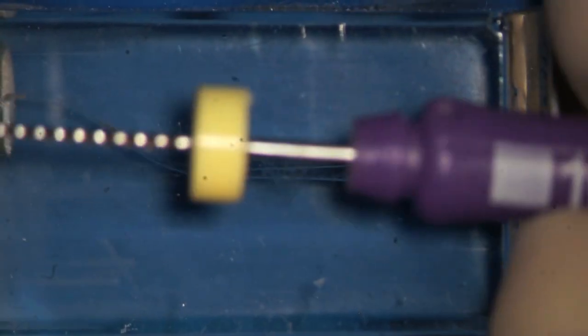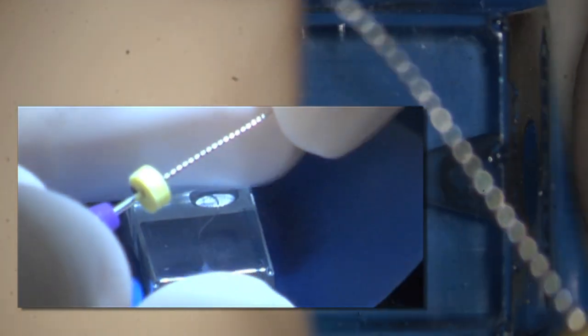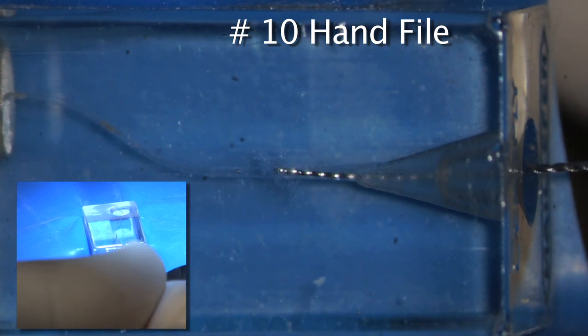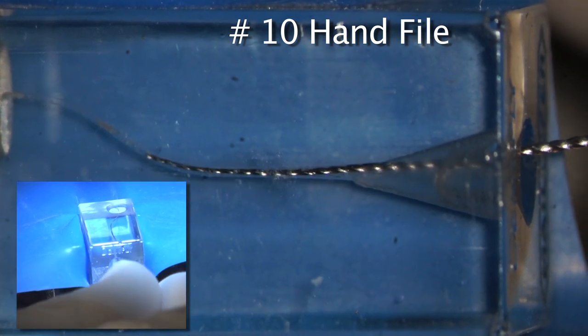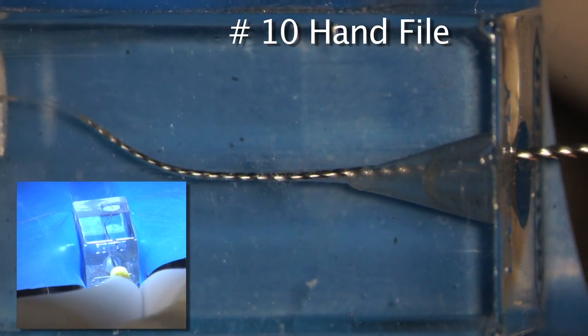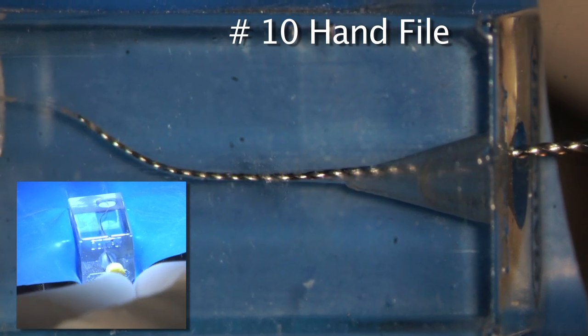So we have a ten file at the diagnostic length, and what I'm going to do is you can use a variety of different ways to pre-curve your instruments, but I'm going to put a little curve on the file. I'm going to exaggerate the curve, I don't know exactly what the curve is, because clinically you wouldn't be able to see. So we'll just put a little curve on the file, and we'll be using a little watch-winding motion to thread the pre-curved file down through the body of the canal. If the file at any time meets resistance, pull. Feed it in a little bit deeper, and pull.